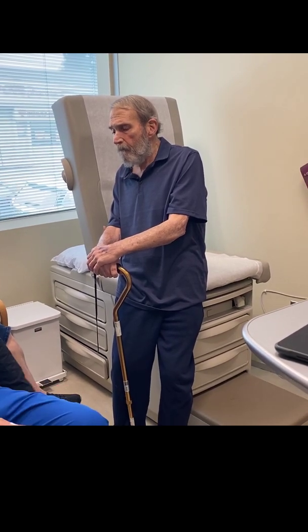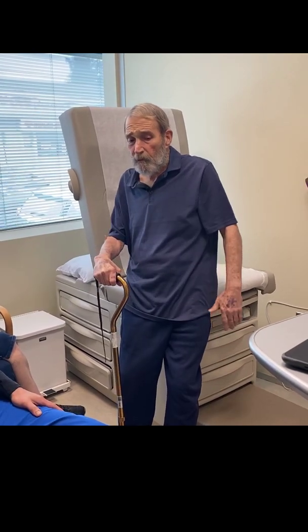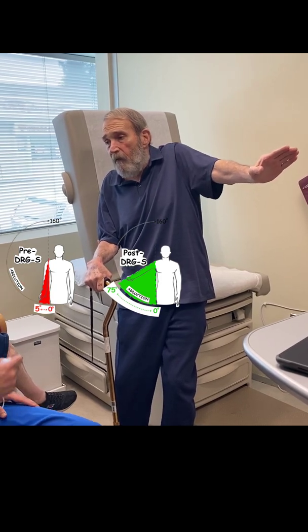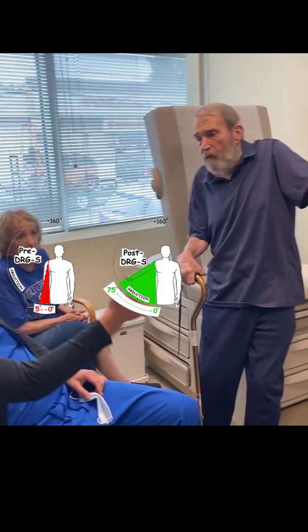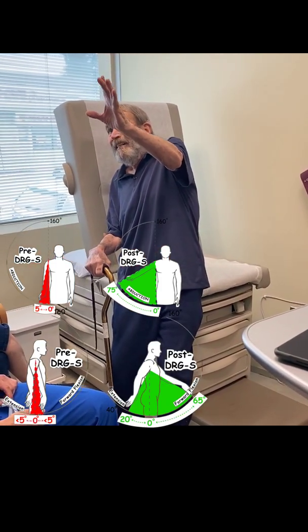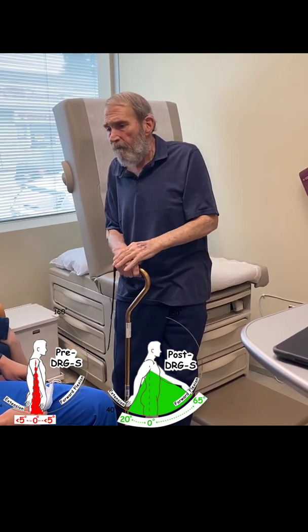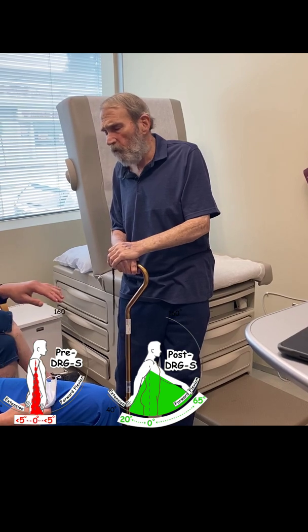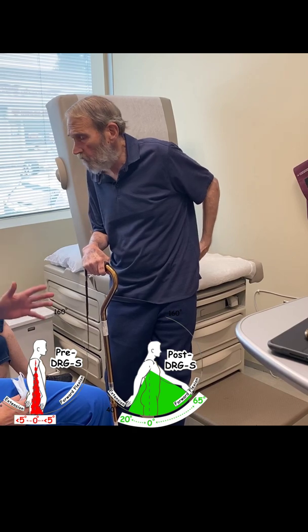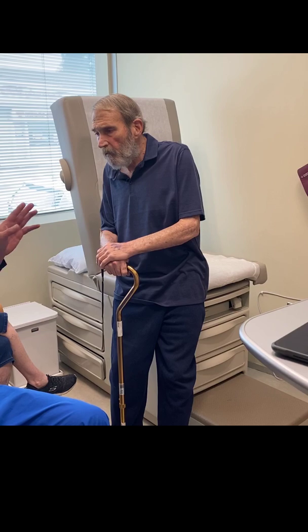So show us — you could go like this before, how far can you raise it now? It's a lot better than it was, almost all the way up. When is the last time you saw him raise his arm like that? Four years ago. How about forward? That's hard. How about reaching backwards? I can get my wallet out now — could not do that before.